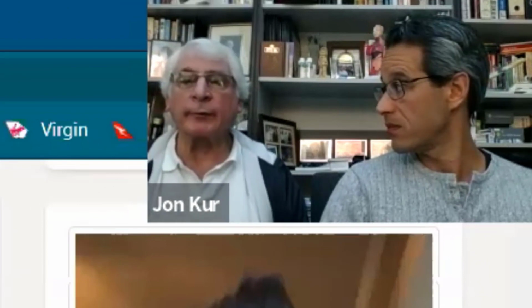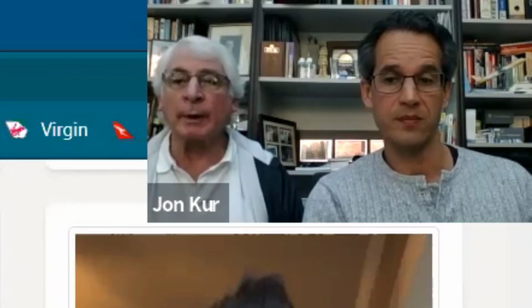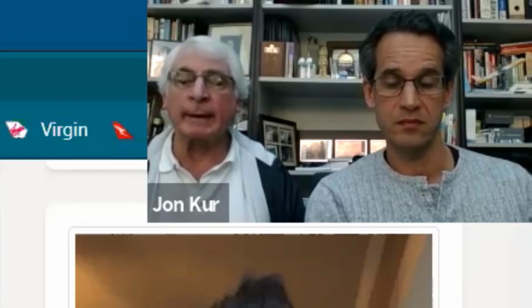It's important to let your clients know that this is not about the end result. This system's really to excite patients, to motivate patients, and to give them a really good idea of how much better they could look if they had any form of cosmetic work done. That's all the system is about. It's not an end result. It's not a result that you can send to the lab.